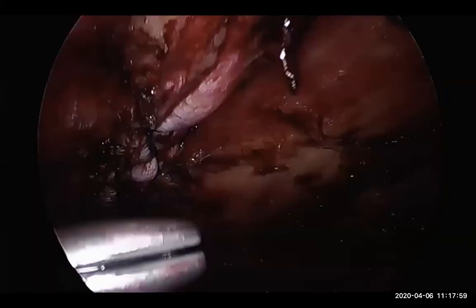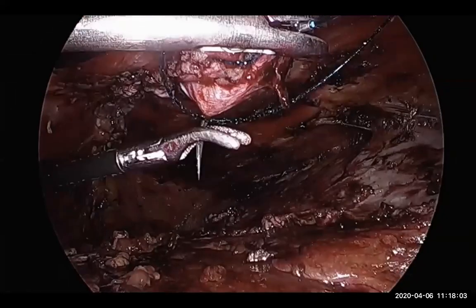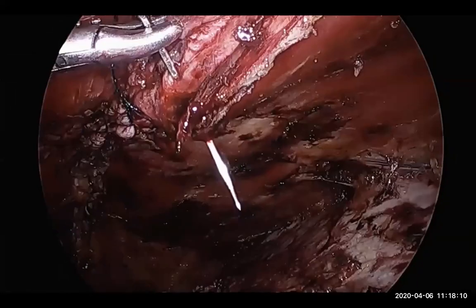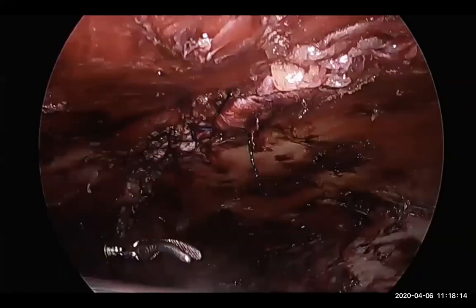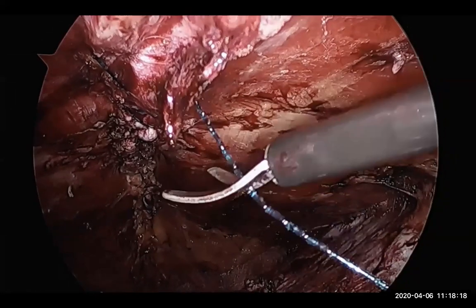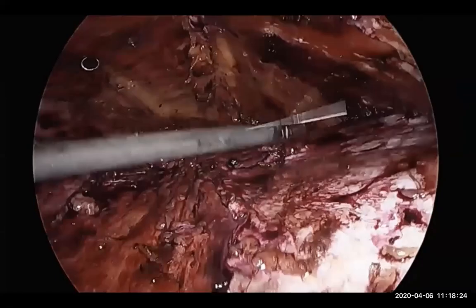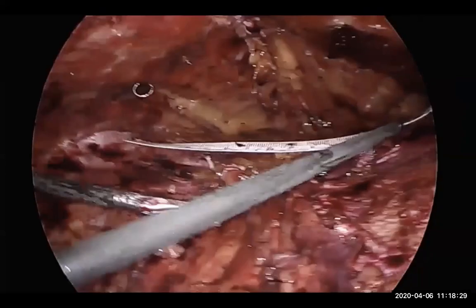So the suture now goes from top down and meets the other suture line, the one which has finished in the center. And you reverse that and you're done. This used to be the most difficult part of the operation before, but it's become much, much simpler with experience. So now you put in a scale and measure the area that you have to reinforce with the mesh.